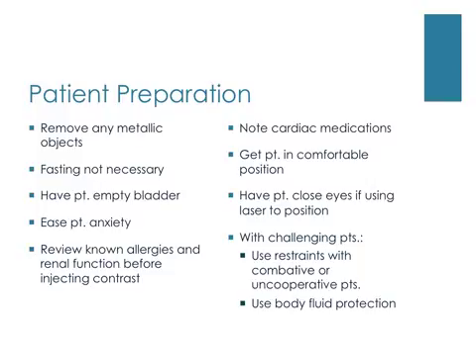Fasting isn't usually necessary, but also you don't want the patient eating a large meal before a contrast study in case the introduction of contrast causes vomiting and nausea, which it is sometimes known to do. You want to have the patient empty their bladder, especially for a longer CT study. You want to ease the patient's anxiety by staying calm during the exam and giving them the description of what all will be occurring during the exam.